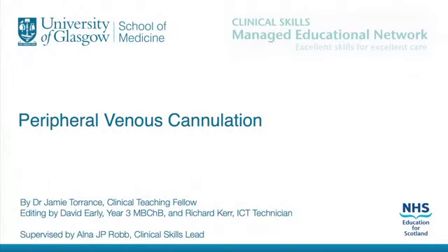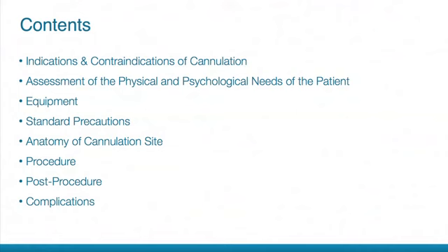Welcome to the Clinical Skills Podcast for Peripheral Venous Cannulation. This podcast will cover the procedure of the insertion of a peripheral venous cannula in an adult patient. Intravenous cannulation is the insertion of a hollow tube into a vein to allow either drainage or installation of substances for a short period of time.